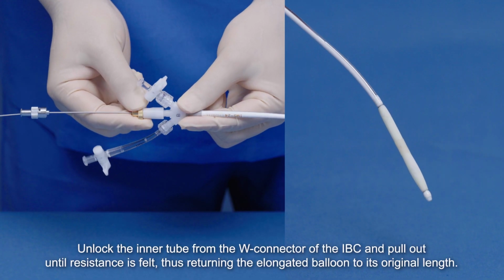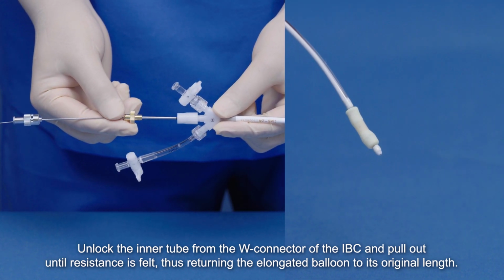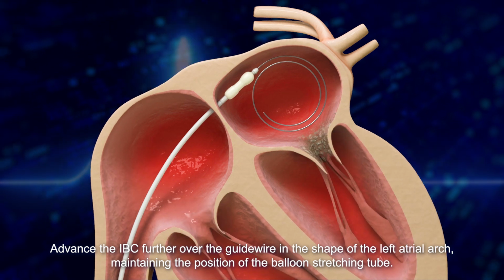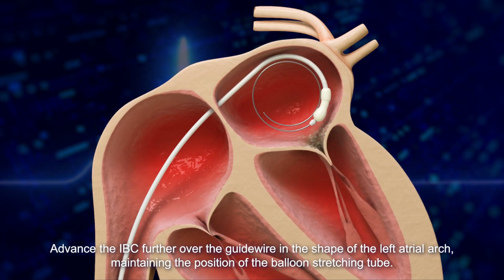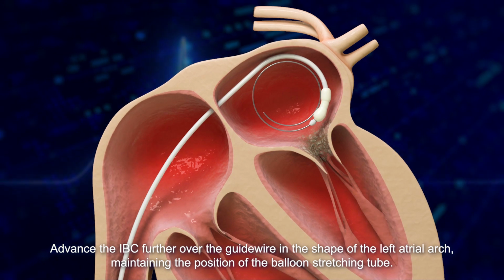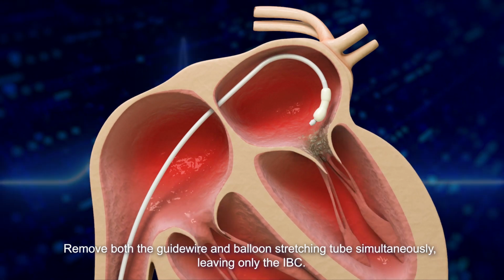Unlock the inner tube from the W connector of the IBC and pull out until resistance is felt, thus returning the elongated balloon to its original length. Advance the IBC further over the guidewire in the shape of the left atrial arch, maintaining the position of the balloon stretching tube. Remove both the guidewire and balloon stretching tube simultaneously, leaving only the IBC.